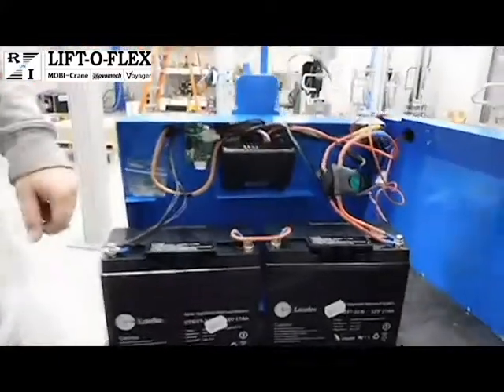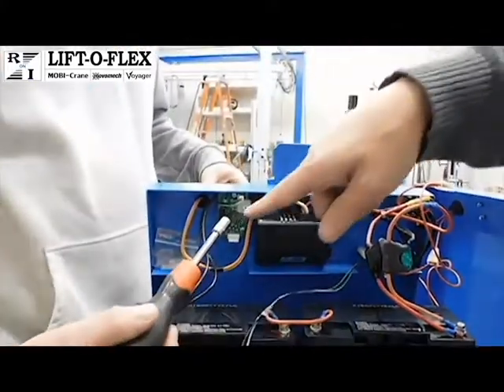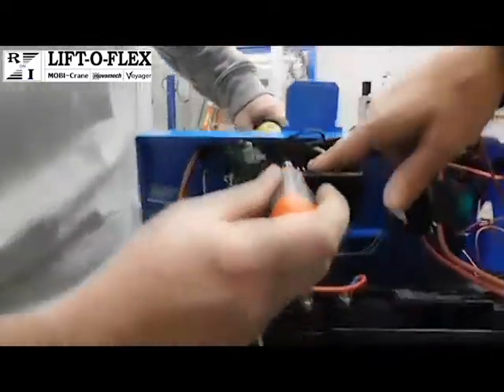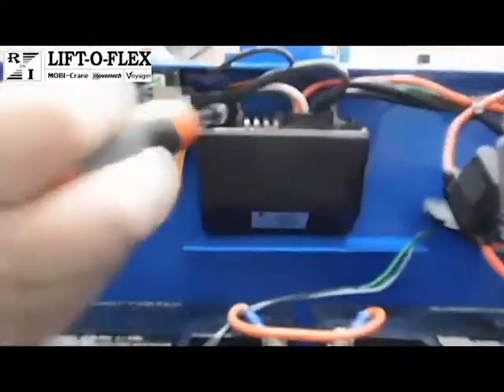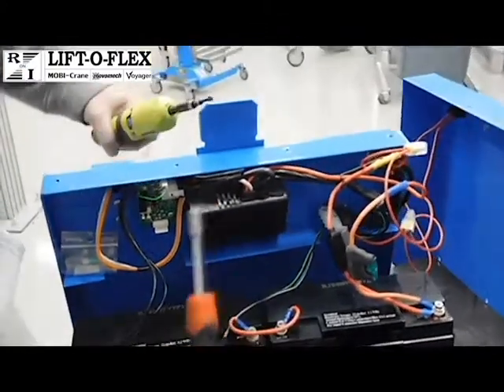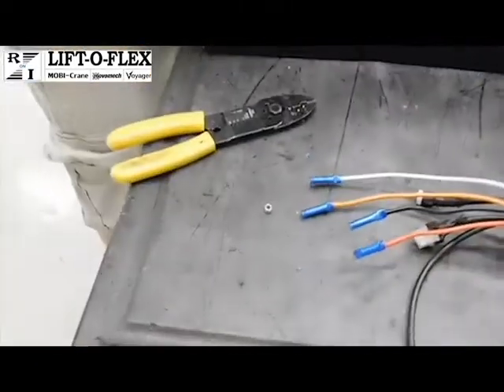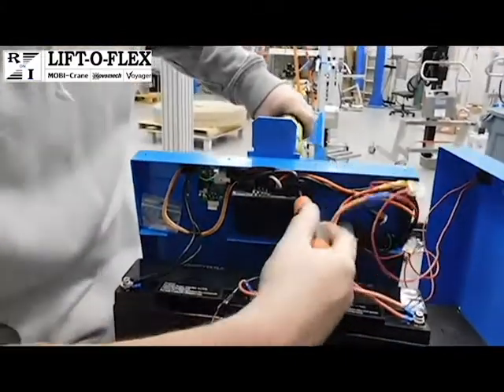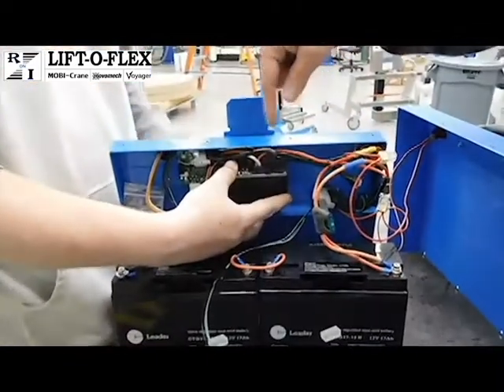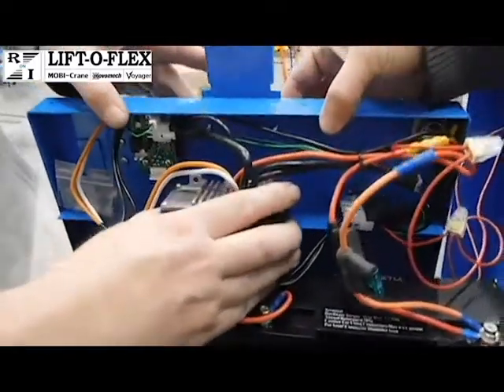To access this card, there's screws on the back, so the power pack needs to be in the upright position. It requires a 7mm socket that hits the lock nut inside, and then it's just a Phillips screw that's behind the power pack. And again, you will need the hardware for the replacement. So that card can now be pulled out and removed. You'll see the 2 screws are still sitting inside the power pack.